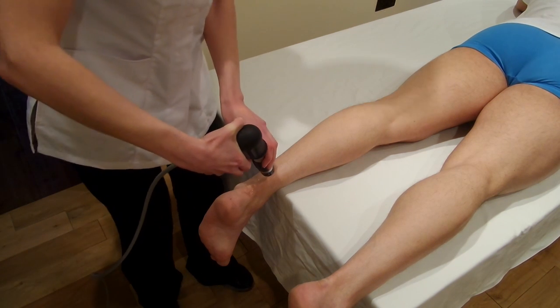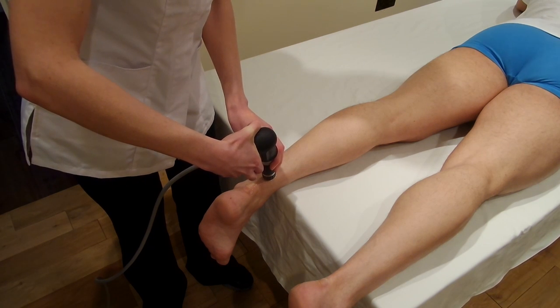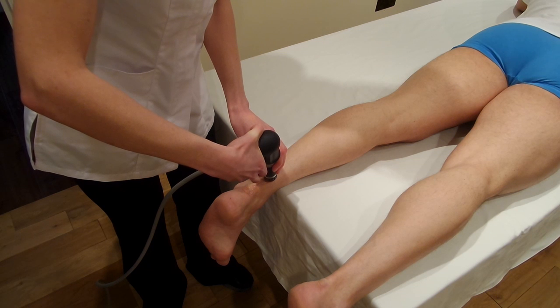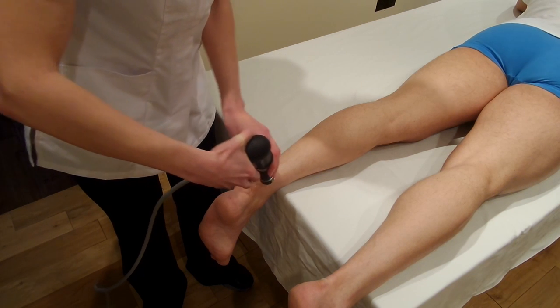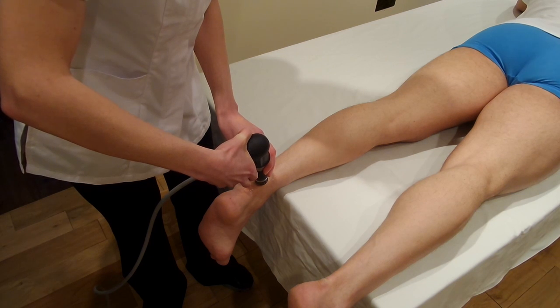It wouldn't be a bad idea if you wanted to do just nine spots at 200 shocks per spot — that would give you 1,800 shocks in total. Or if you wanted to do 12 spots at 200 shocks per spot, depending on how big the Achilles tendon is and how large the affected area is, that would bring you to 2,400 shocks.